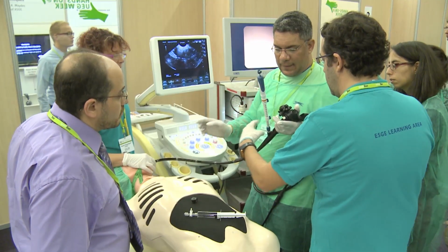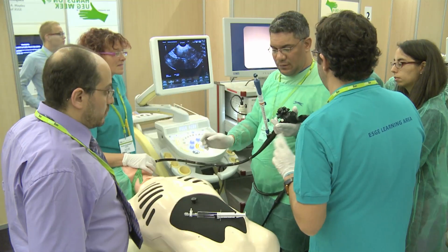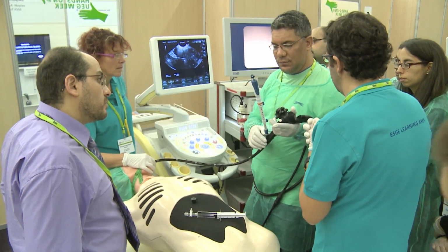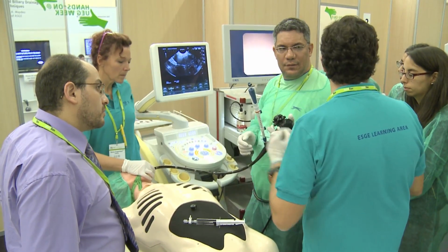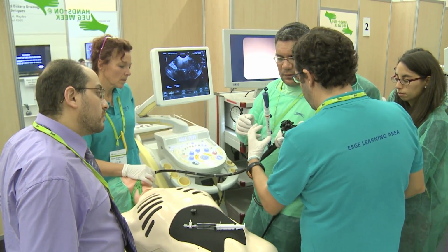See, she's holding the scope for you, so you are never going to lose the position, ever. That's why this is a combined procedure, because you will need four hands. She's going to hold the scope for you, and that's going to make your life much easier, okay? So now you release this first wheel.